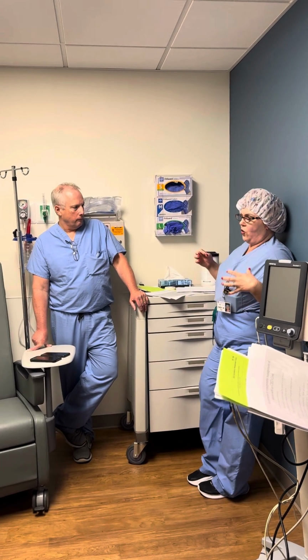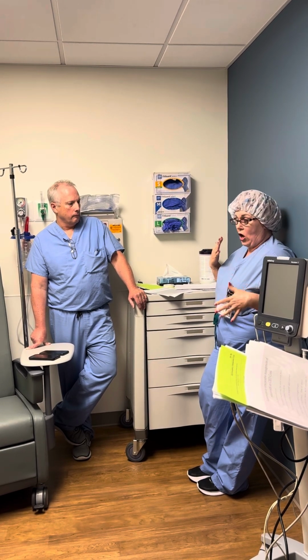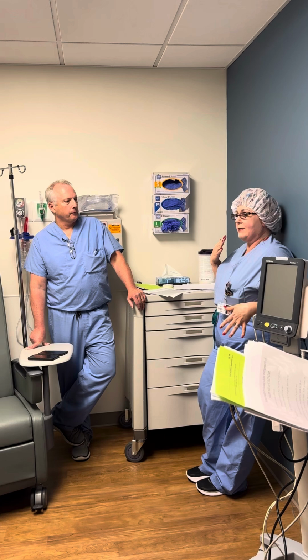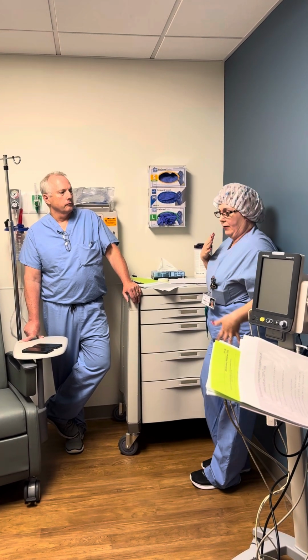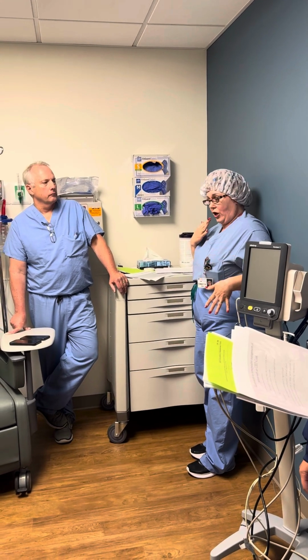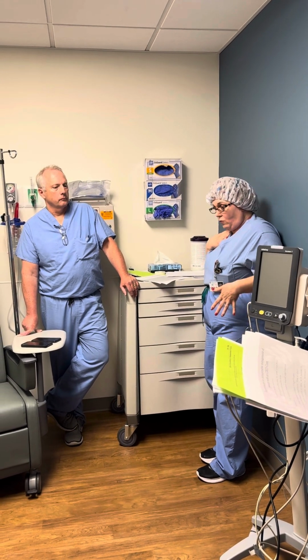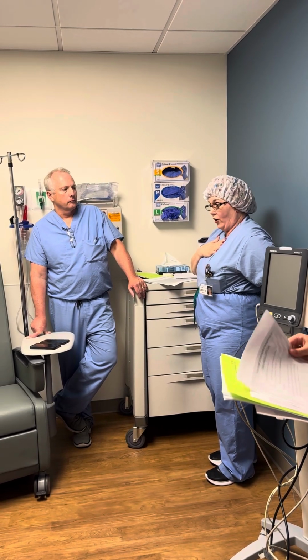If you have to put the defibrillator pads on, you don't place them over the device. That would be a big no-no. There are pictures on them showing where to place them. You can either do one side and opposite, or front and back, depending on where you're working.